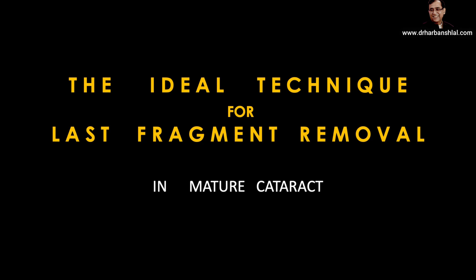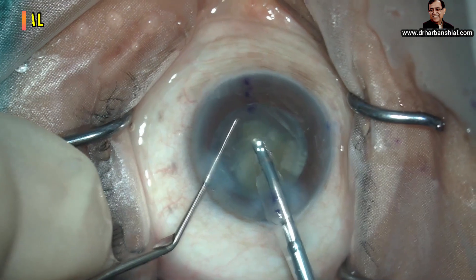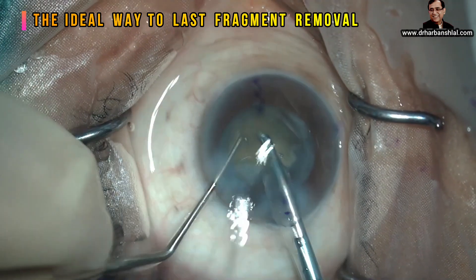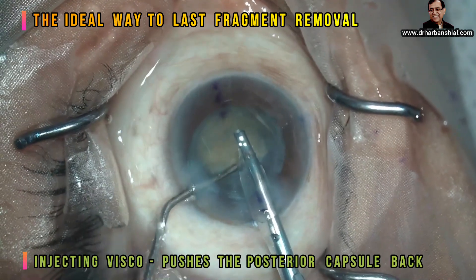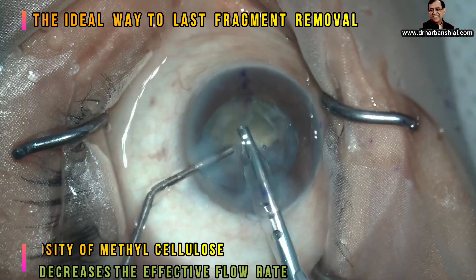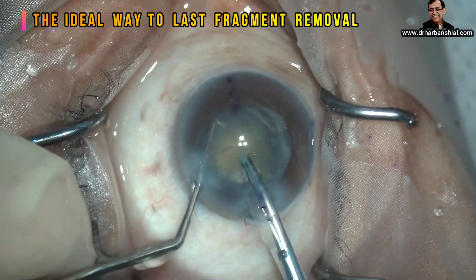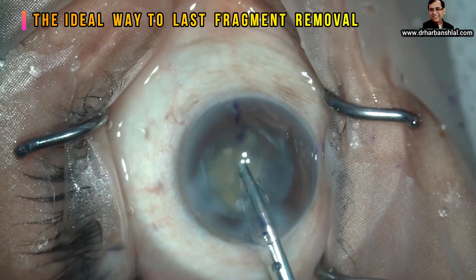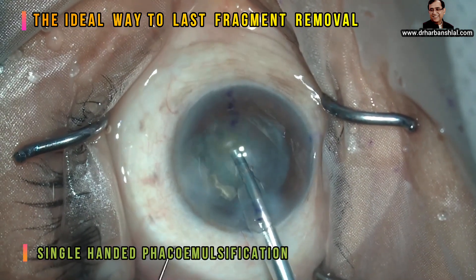Let us now see how to ideally perform the last nuclear fragment removal in a case of mature cataract. Here we can see an eye with a mature cataract. Phacoemulsification is being performed with a large chopper and a Kelman tip. At the time of last nuclear piece removal, always remember to inject some viscoelastic — injecting viscoelastic pushes the posterior capsule back and the viscosity of methylcellulose leads to a decrease in effective flow rate. Now divide the large fragment into two pieces either with the same chopper or with a smaller one. Notice that the chopper has been removed to prevent leakage from the side port, and single-handed phacoemulsification is being performed.